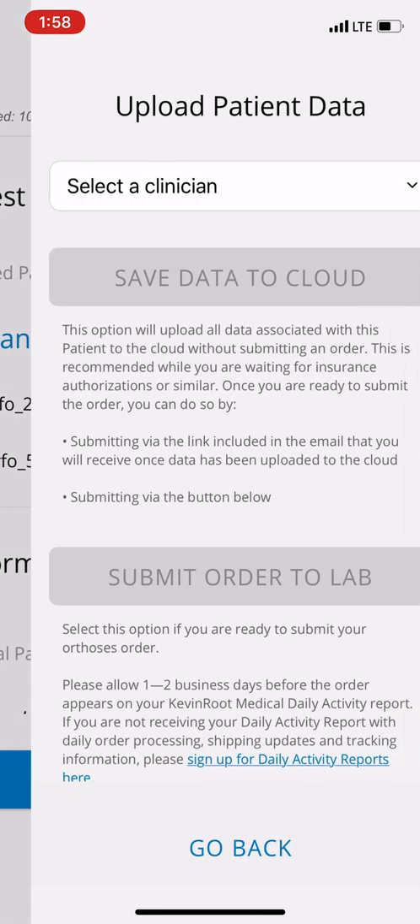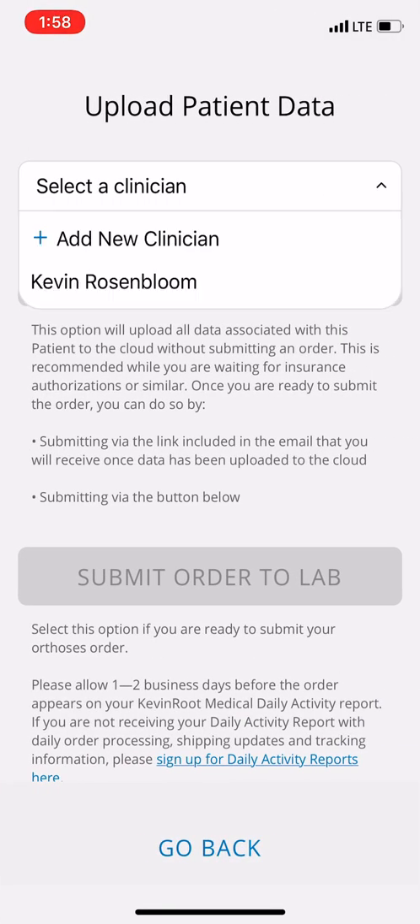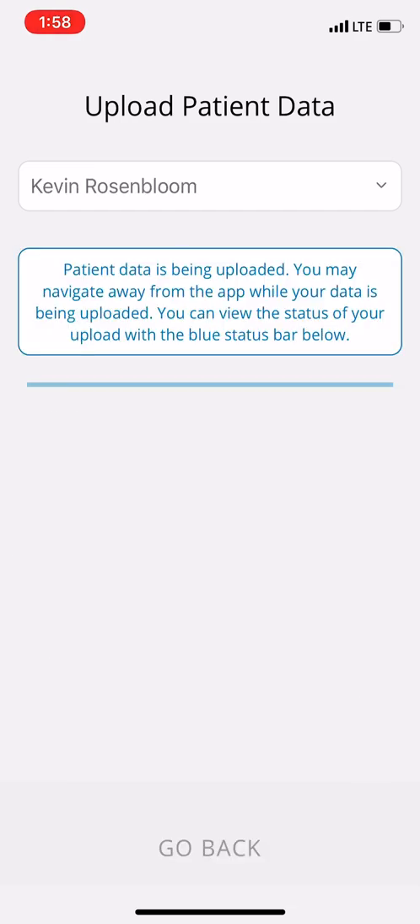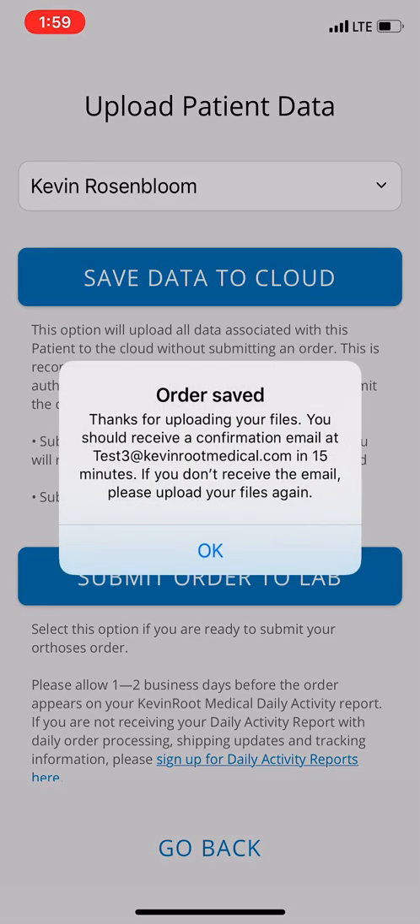Now we're ready to upload. I'm going to hit the upload button and select the clinician. There are two options: one is to save data to the cloud, and the other is to submit the order to the lab. In this case I'll save the data to the cloud — that takes all the data off your phone and puts it into the server. The email you used — test3 at KevinRootMedical.com — is going to get an email that says you've saved this order and it's pending. Anyone on your staff can manage the order from the email.